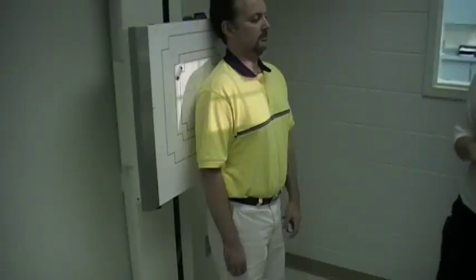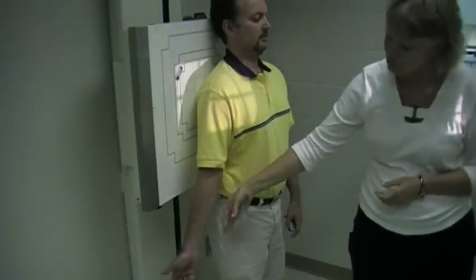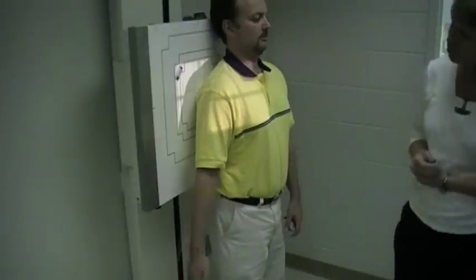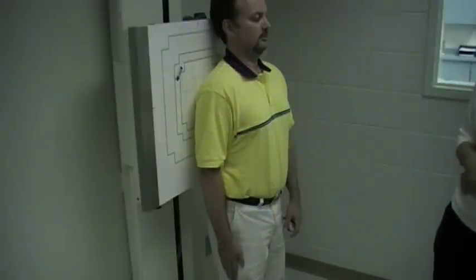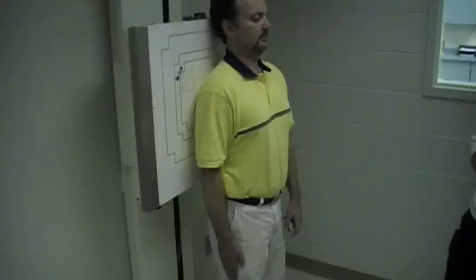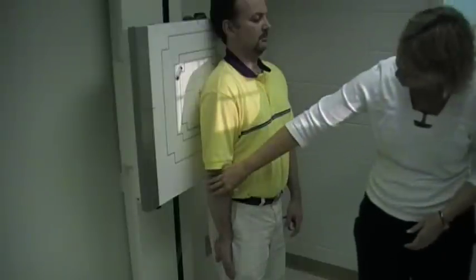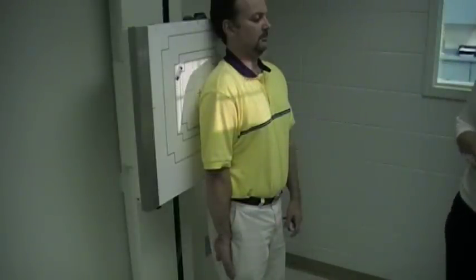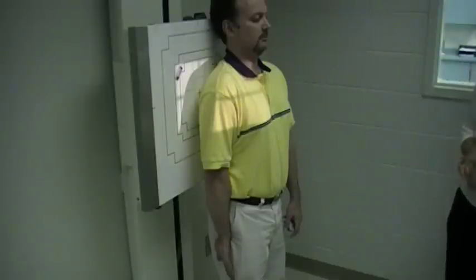So for the first one, we'll do the external rotation, which the hand is in supination. The second projection we'll do is a neutral, where the hand is just placed down at the side right against the leg. And then the third projection is the internal rotation of the arm, where the back of the hand is up against the leg. So this is our 3 different AP projections for the shoulder.